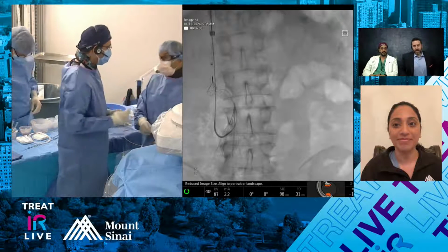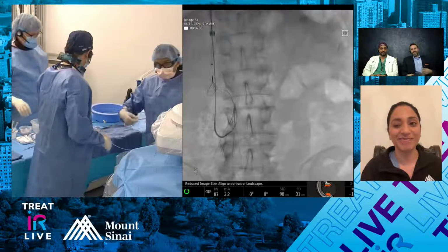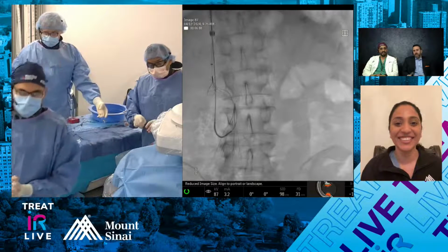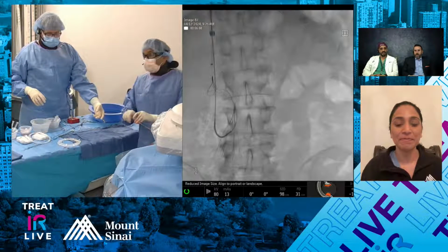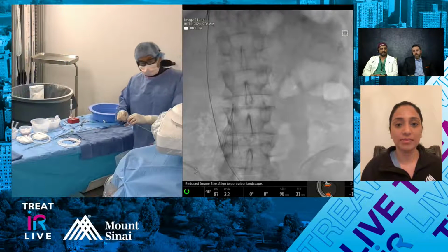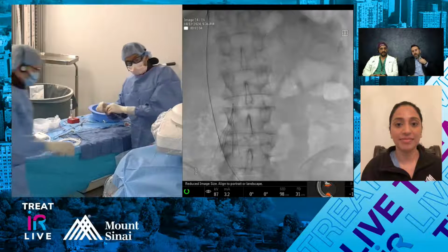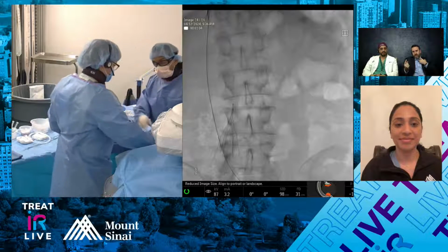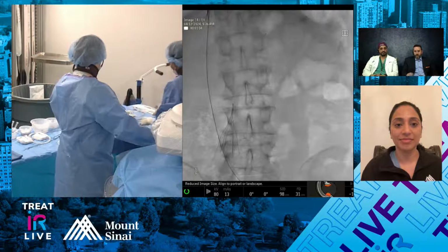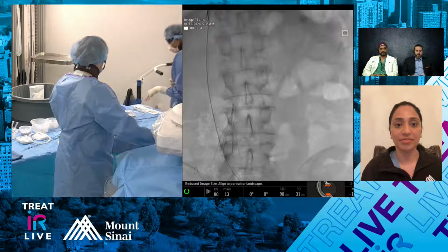Now that you're at UCLA, I think you have to use hangman a little bit more, right? Isn't that kind of obligatory? Let's try it. But yeah, like you said, it depends a little bit on the filter type. Some of them have that closed cell portion, so you can't necessarily go all the way up, and that could actually tilt it a little bit more. The Option specifically, unless you want to go into the closed cells at the top, could be difficult. Whereas other types, like a Celect, where you could hangman all the way to the top, might be a little bit easier.